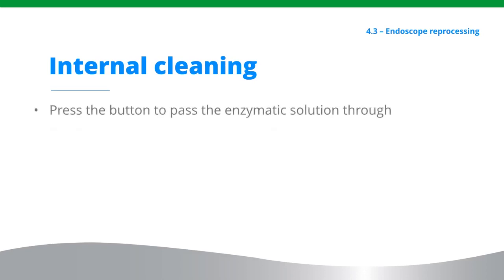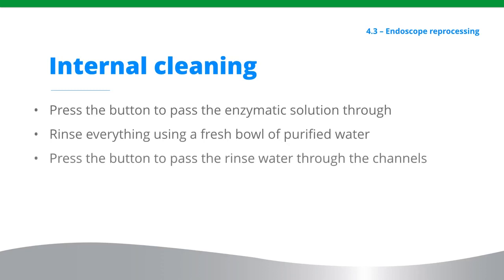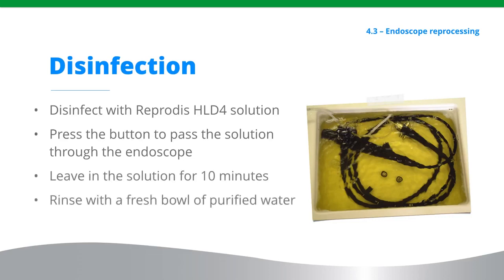Press the button and pass the enzymatic solution through until the solution starts to fill the aspirator bottle or the syringe. Rinse everything using a fresh bowl of purified water. Press the button as before to pass the rinse water through the channels. Disinfect with Reprodis HLD4 solution to maker's dilution by pressing the button and passing the solution through the endoscope until it emerges into the aspirator bottle or syringe. Leave the instrument in the solution for 10 minutes, then rinse as previously with a fresh bowl of purified water.